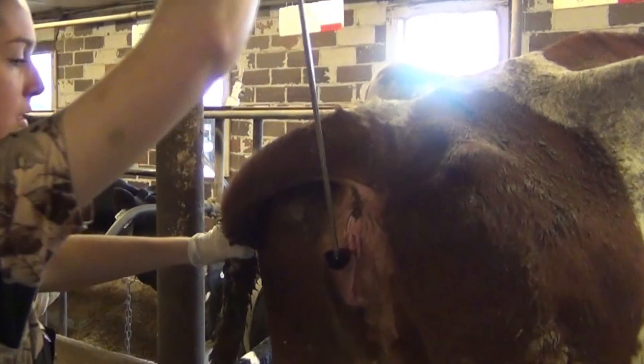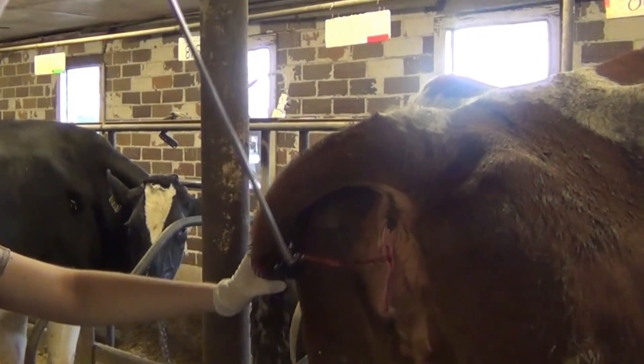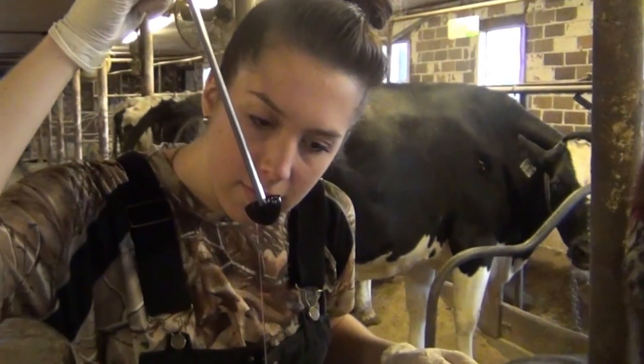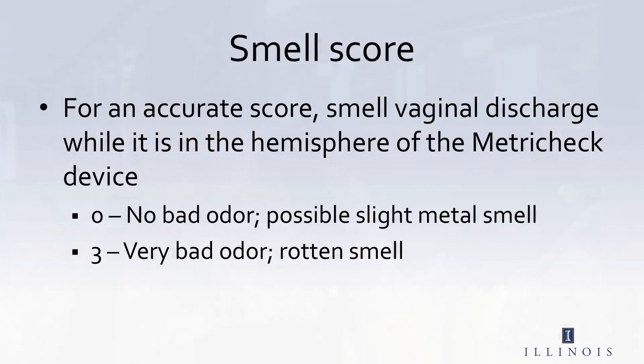Once you have an adequate amount of discharge in the hemisphere of the Metricheck device, you can then score it. The first score we do is a smell score. You want to smell the vaginal discharge while it is in the hemisphere of the Metricheck device in order to get an accurate scoring. A smell score of 0 will have no bad odor or have a slight metal smell to it. A smell score of 3 will have a very bad odor and smell rotten, which means that the cow has metritis.